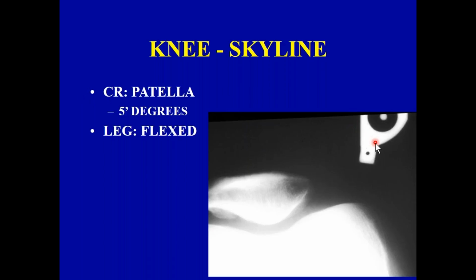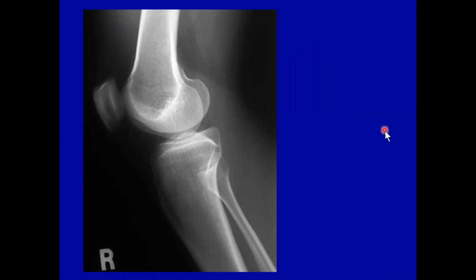This was done, this is the left side, and in this case the patient was recumbent, because if this white dot is where the laser dot is now, that is upright. So you did an AP and a lateral view first. Now we're on to more specific examinations.